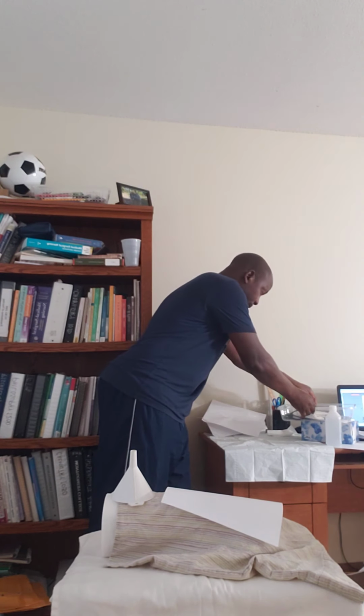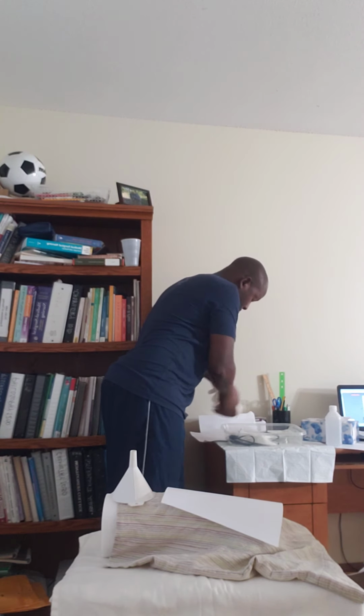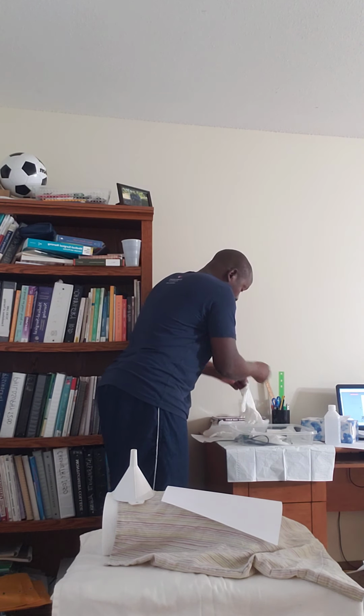Why am I removing this one? Because one hand is going to be with the gloves. Now pretend this one is the sterile gloves again. So one hand will be with the one glove. Then now let's continue. So this is sterile gloves.